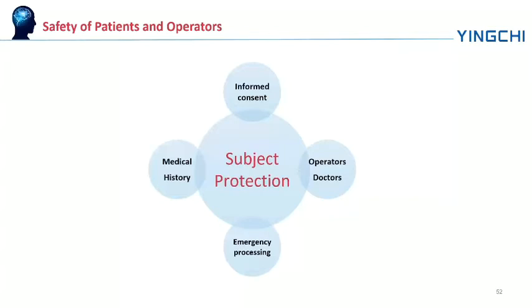We need to have emergency procedures in our treatment room or clinical trial site. As for the operators and doctors, there was no report of side effects or damage.